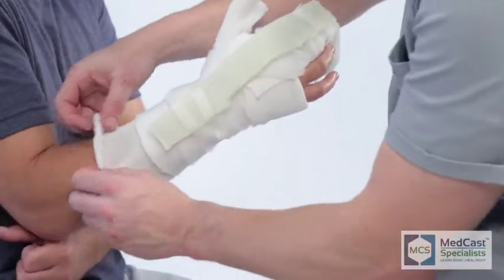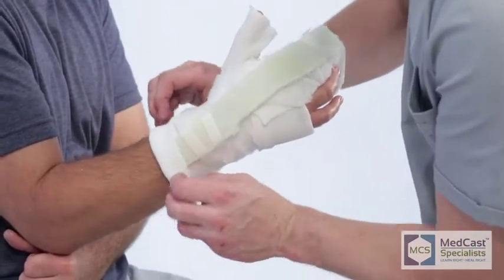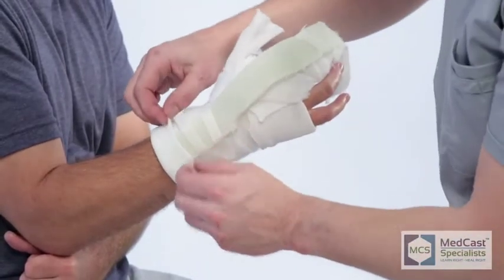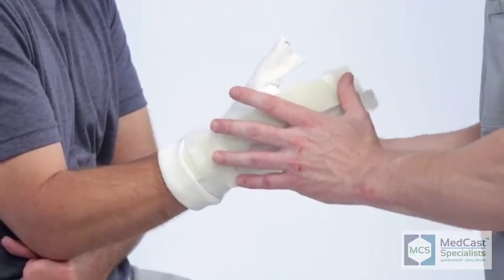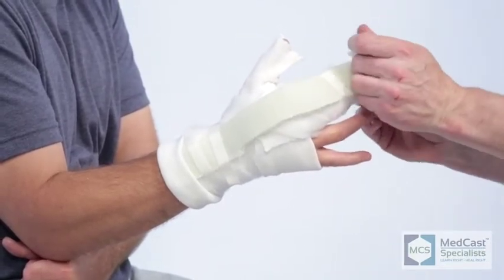Folding the stockinette back, we doubled it up there. That gives you a little padding for the splint material so it doesn't rub on anything or it's not exposed. Also helps hold it in place as you fold it back and keep those ends exactly in the place that you want it to be in as you apply your cast material.